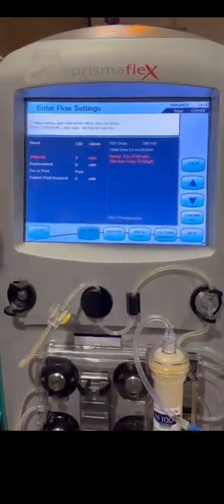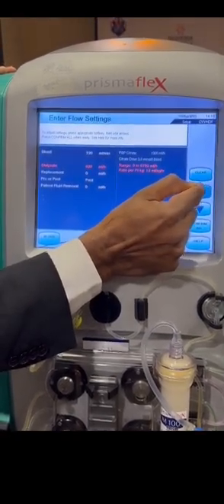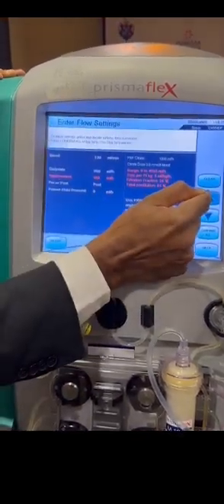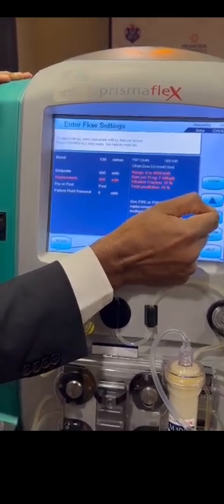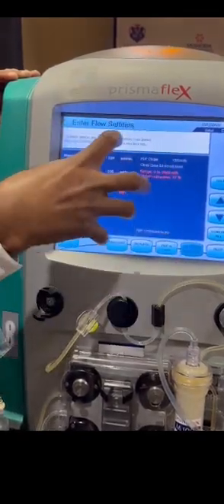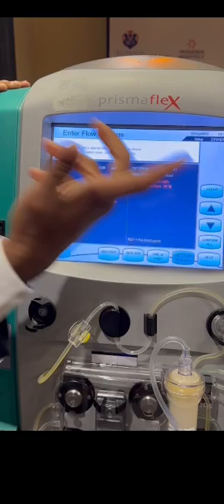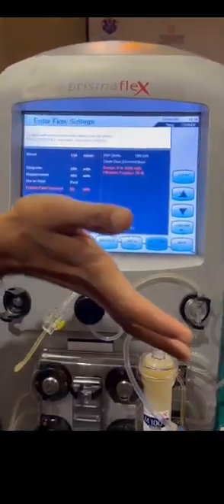Okay. Then dialysate. I'll tell you how to calculate this. I'm just keeping it at 800. Replacement, that is post replacement. Okay, post. 400. Then patient fluid removal, that is UF. UF is named as patient fluid removal. That is also per hour. Maybe 50 ml per hour, maybe 0 ml per hour, 100 ml per hour. If the patient tolerates, we can gradually increase the ultrafiltration also.